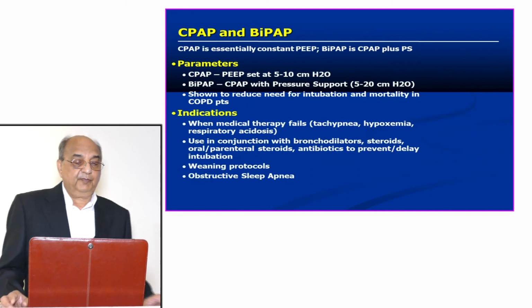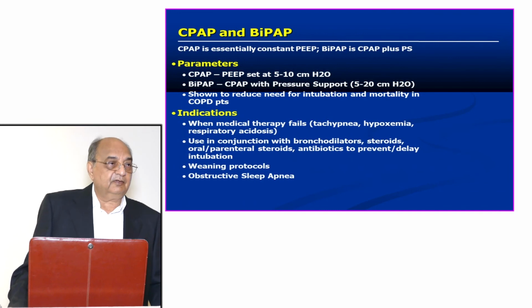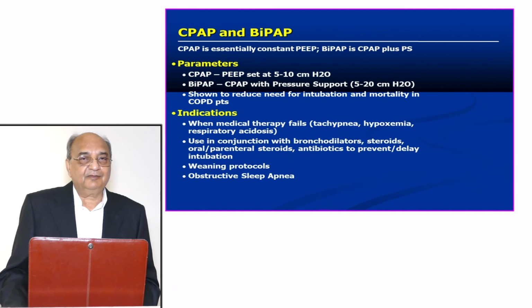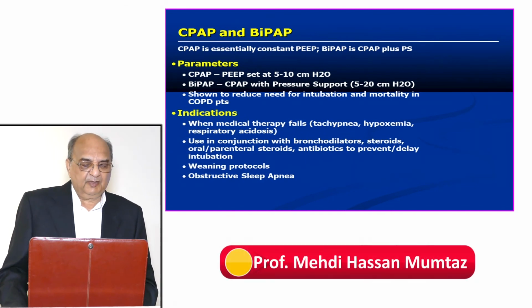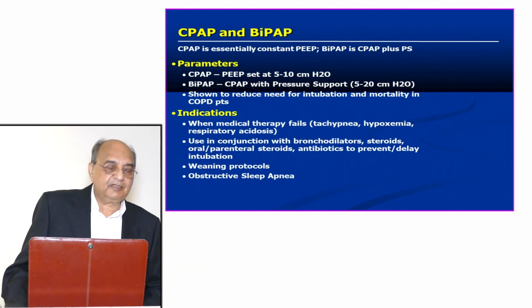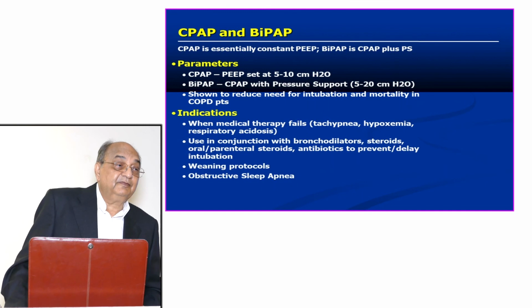Now, CPAP and BiPAP. CPAP is very commonly used by the pediatricians for neonates. They put the nasal prongs for CPAP, or a tube or mask. Nasal prongs, I don't know how much effect they get. I'm always skeptical about it, because to have the pressure in the lung with nasal prongs, if the child's mouth is open, it will not let the pressure build up. How can you say it is effective CPAP?